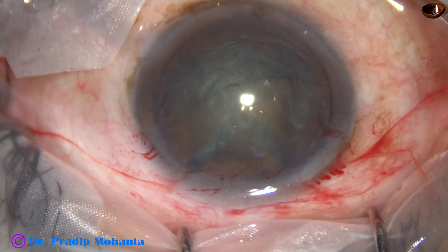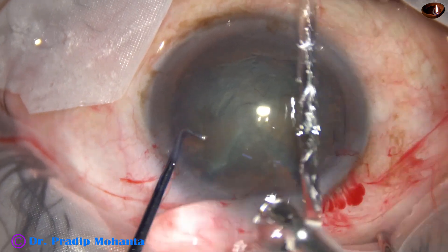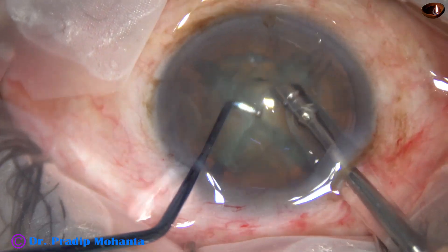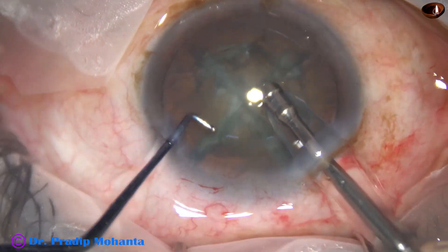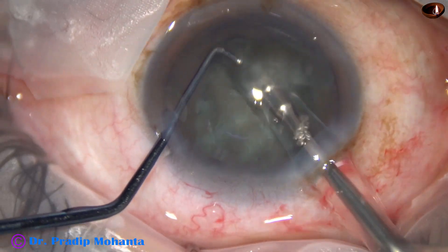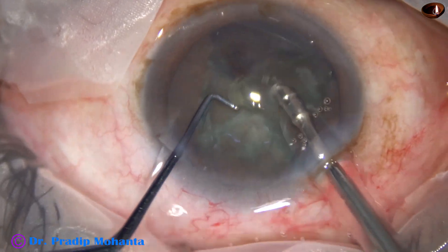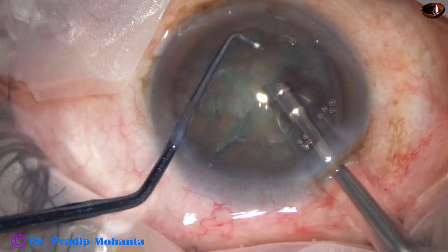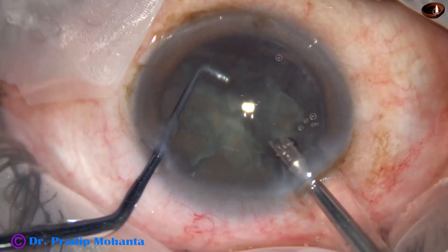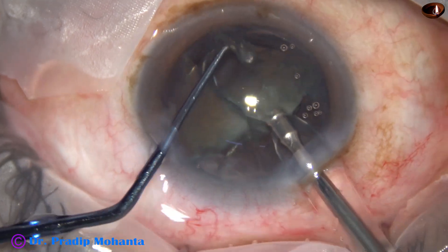Let's go again. And now the feco needle goes in with its bevel down. Some superficial cortical lens matter is removed. And now I rotate the nucleus for some time. And now I start emulsifying the nuclear pieces. One piece removed. This is the second piece — this is also removed. Emulsification is being done with 40% ultrasonic energy.